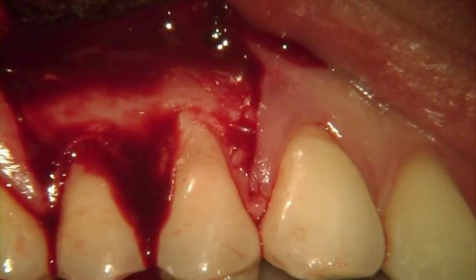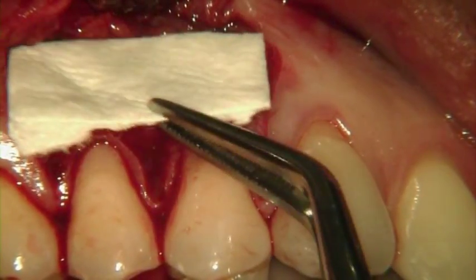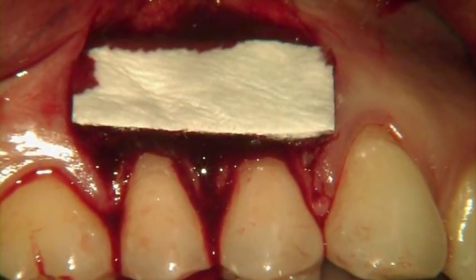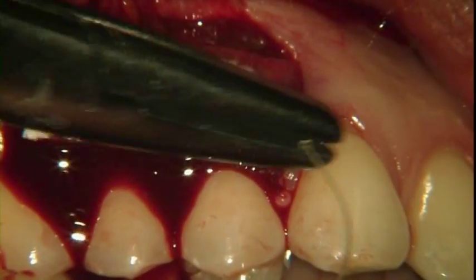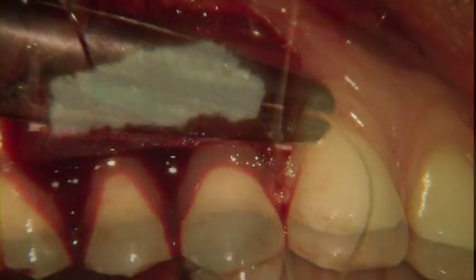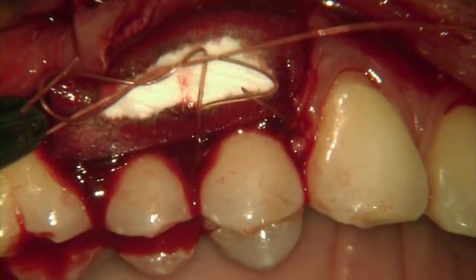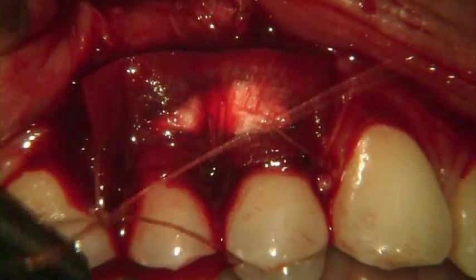Following proper sizing and trimming of Mucograft, the matrix is carried dry to the site and positioned to cover all exposed root surfaces. The surgeon allows the Mucograft to sit passively and become saturated with the patient's blood. Proper immobilization of Mucograft collagen matrix is recommended when treating recession defects. Mucograft is sutured interproximally at each papillary region using the suture material of your choice.